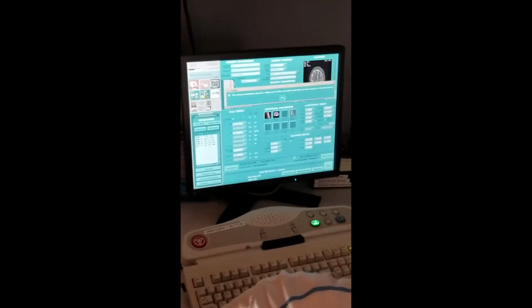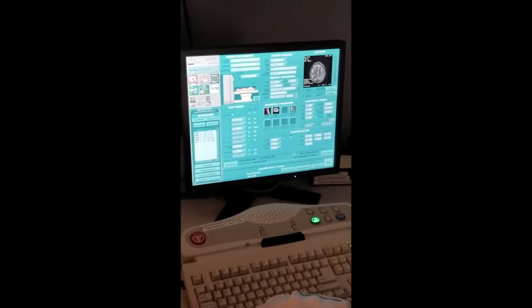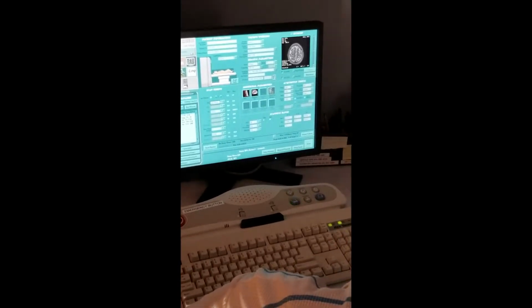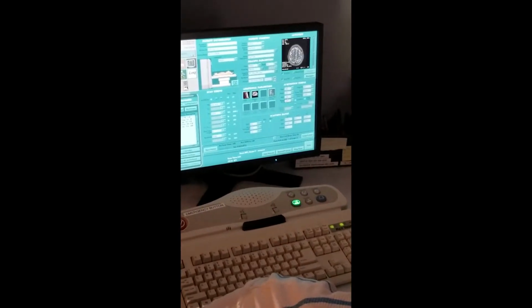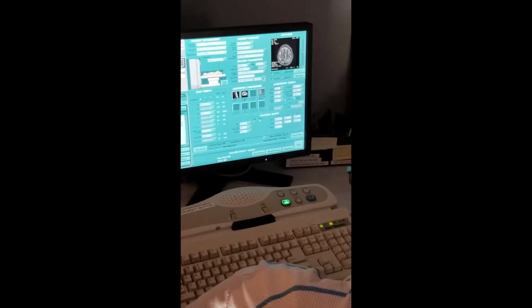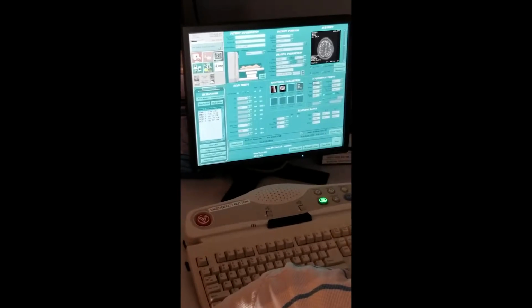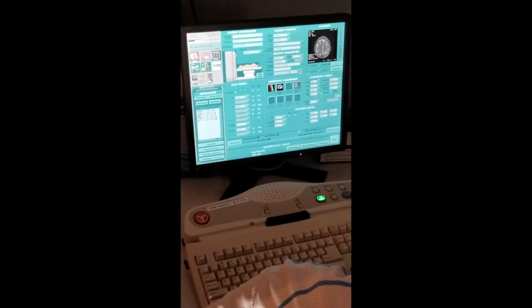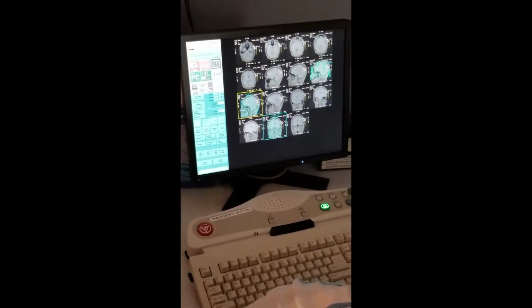We did not go over many things in here. All we concentrate on is these two. But eventually we're gonna go here, here, here, there, and we're gonna manipulate here a lot. A lot of manipulation here. Okay? Now, what is the phase field of view on sagittal? What's phase field of view here? 0.75. I know I don't want to teach, but I can't help myself.